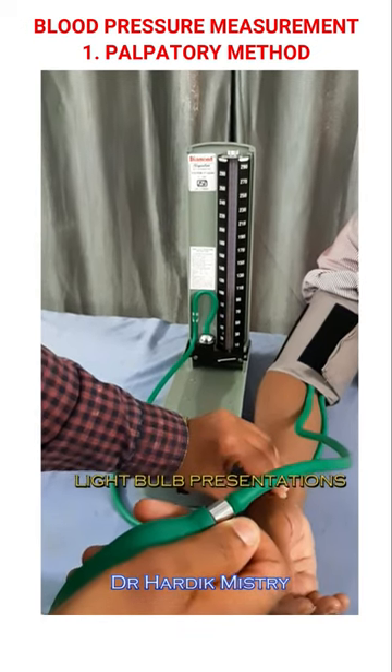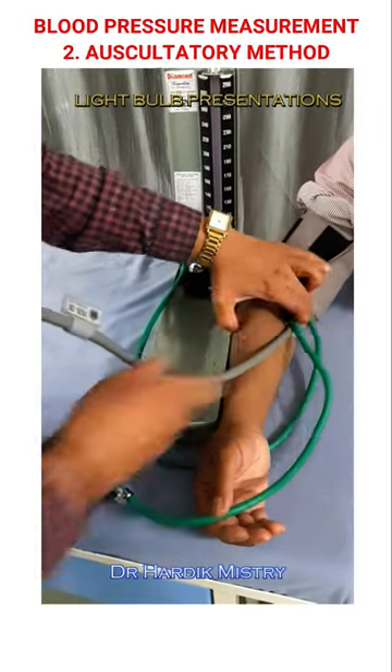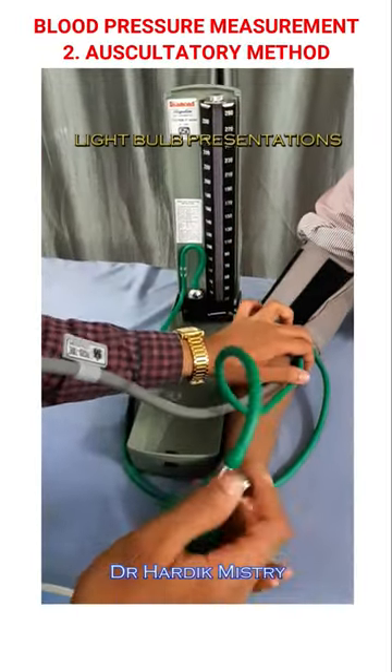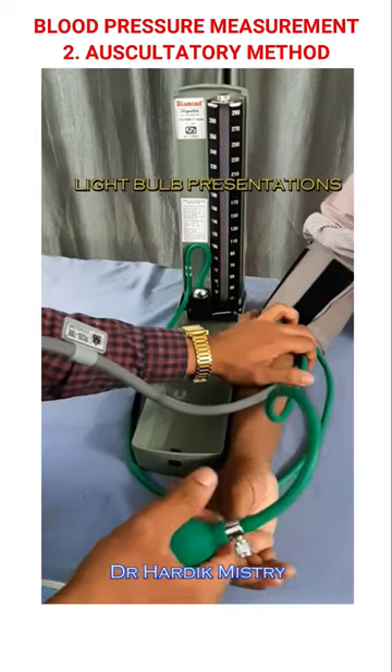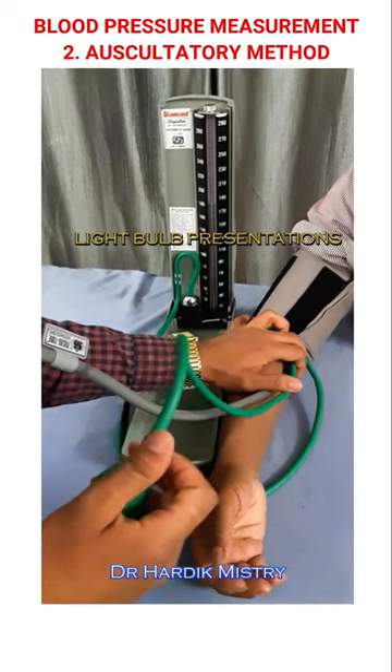The palpatory method only measures systolic blood pressure. For the auscultatory method, put the stethoscope over the brachial artery, which is located medial to the tendon of the biceps. Close the leak valve screw. Raise pressure in the mercury manometer up to 30 mmHg above the palpatory method systolic blood pressure.